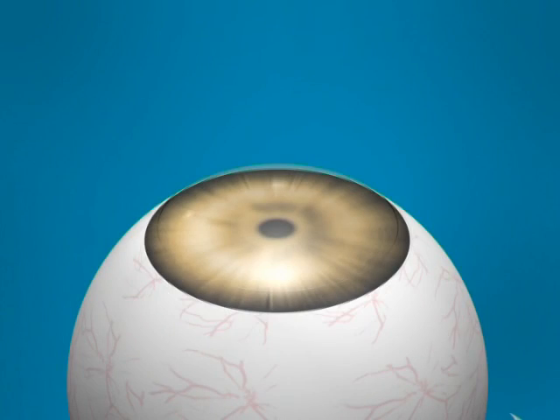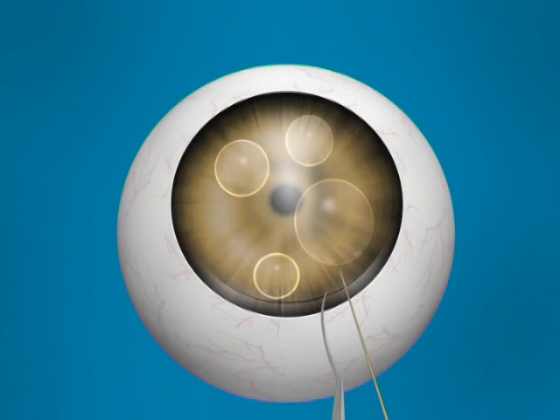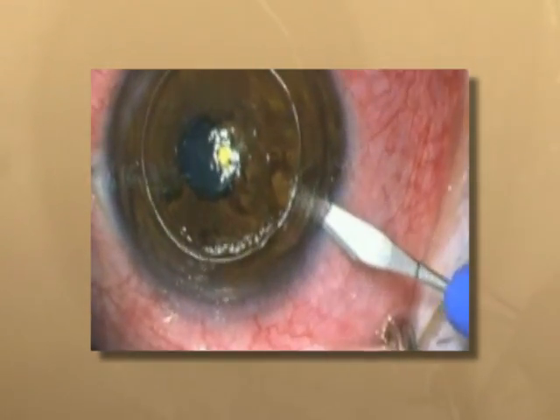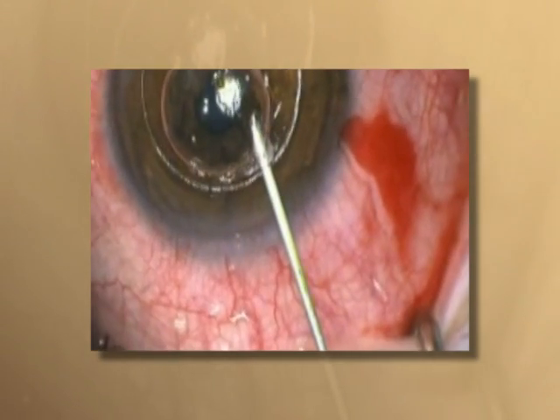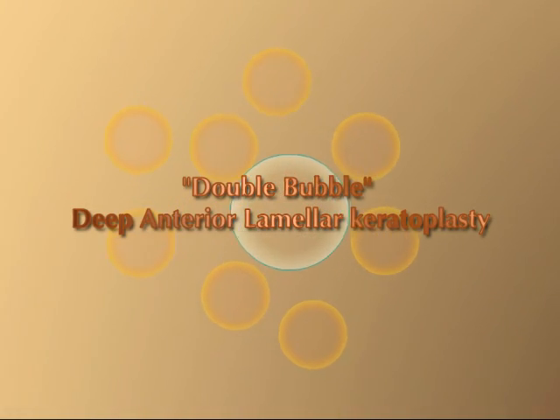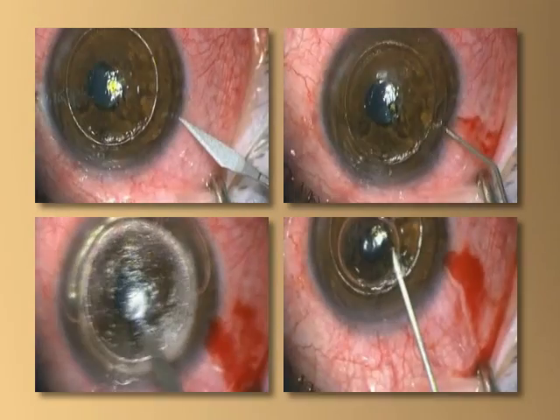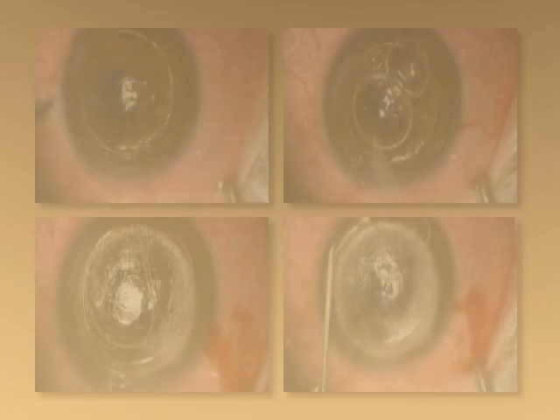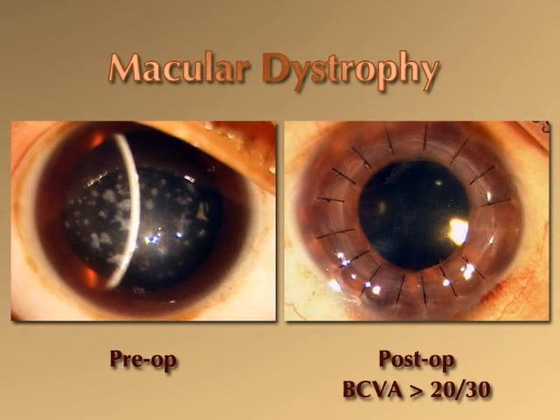A second advantage of our technique is that decompression of the AC prior to the injection of the small bubbles allows space for the Descemet's membrane to bulge inward on injection of the big bubble. This reduces the resistance offered by the cornea of an intact eye, allowing the injection of the big bubble of air into the corneal stroma. We believe that our technique of double bubble deep anterior lamellar keratoplasty has the potential to increase the success of standard big bubble deep anterior lamellar keratoplasty in patients with anterior stromal corneal pathologies.